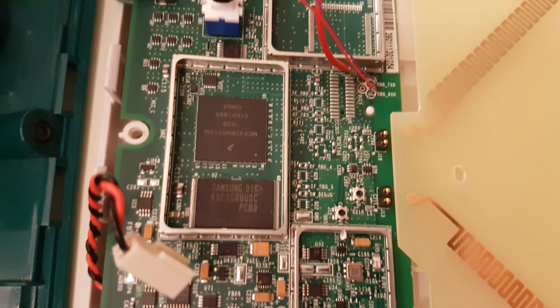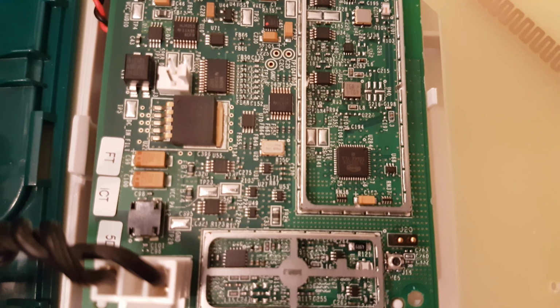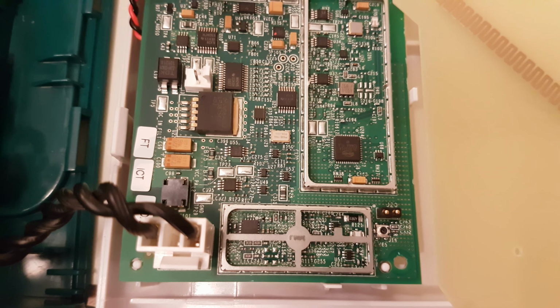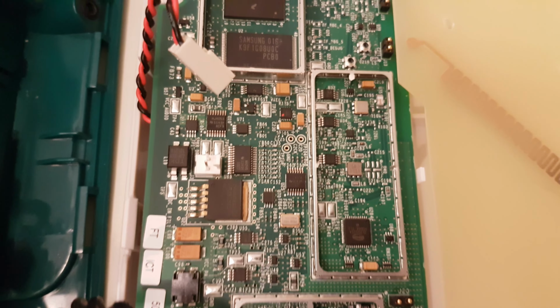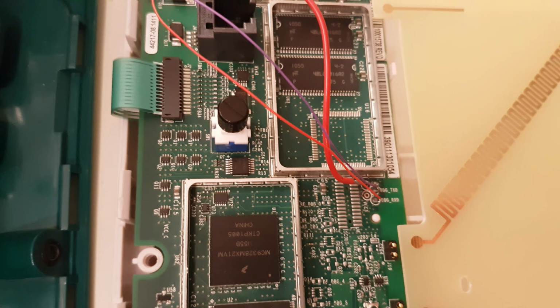There are some issues with the software that will hopefully be addressed and have been reported to the vendor. So at some point, hopefully I'll be able to talk about those. So that's a walkthrough of this board.